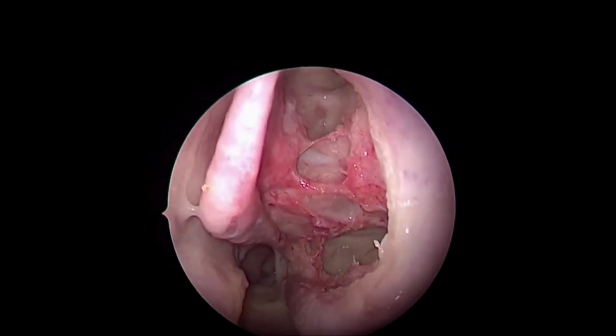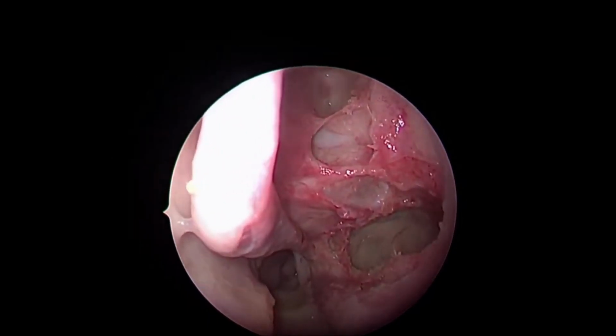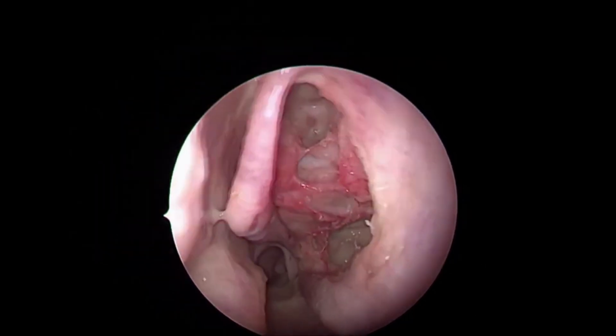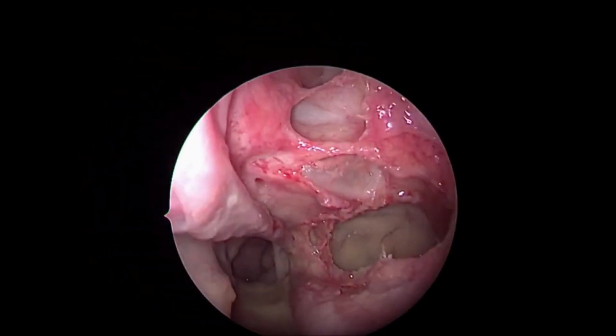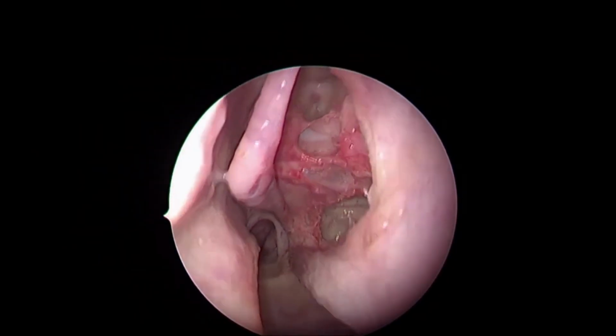Now, to finish off this sinus surgery on this side, what is left behind? What is left behind is the posterior ethmoidal sinus work and the sphenoid sinus work.